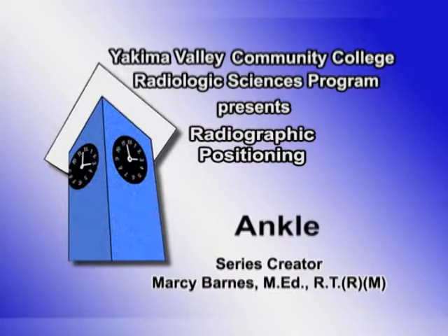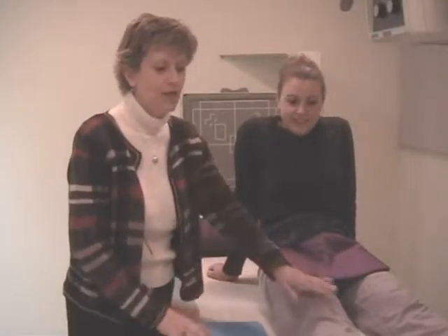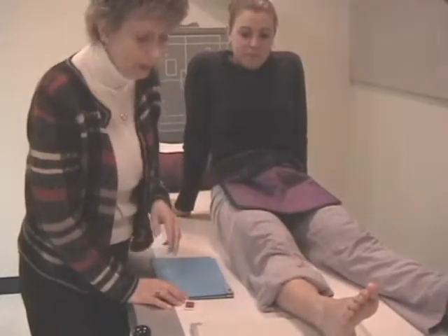Ankle. The ankle procedure is the topic of this lesson, and we've got Jacqueline on the table. You can tell her right leg is the one that's injured because it doesn't have any shoes or socks on. Now we've rolled her pant legs up as well.